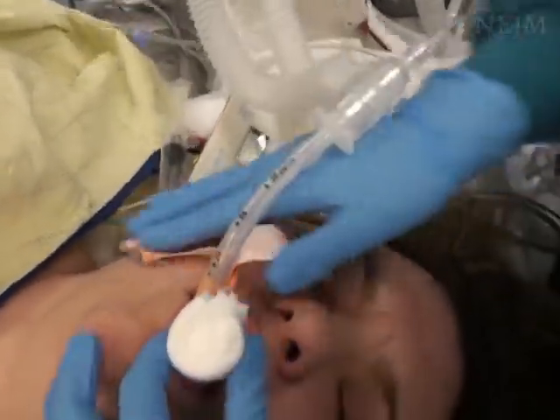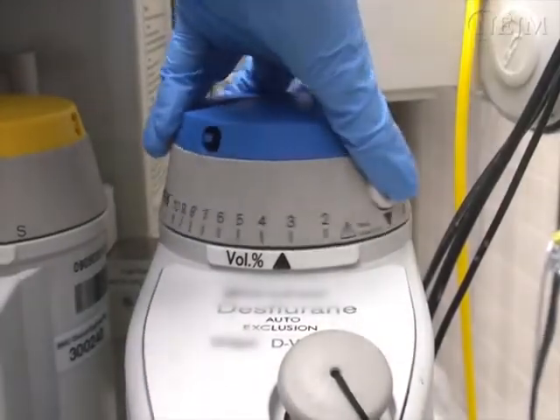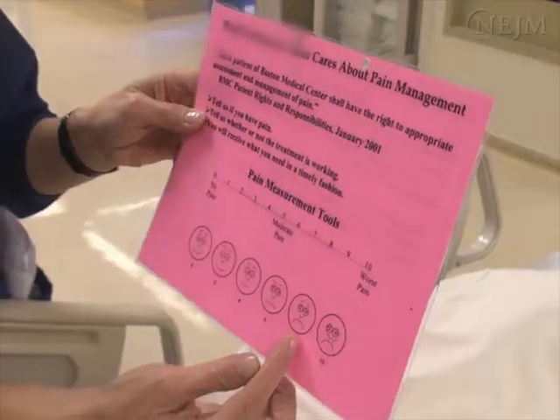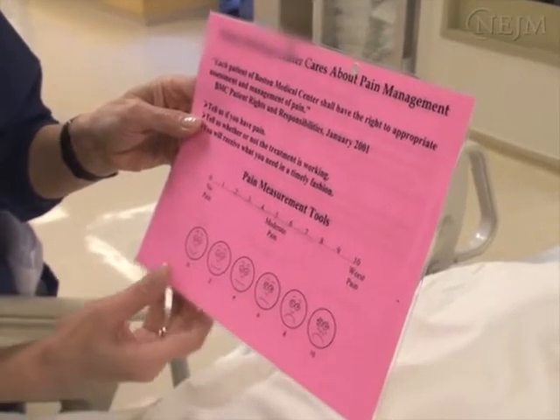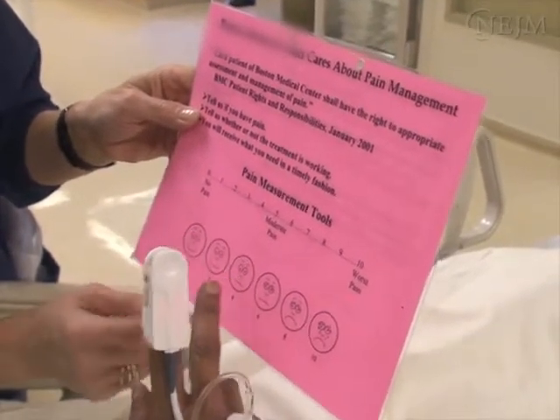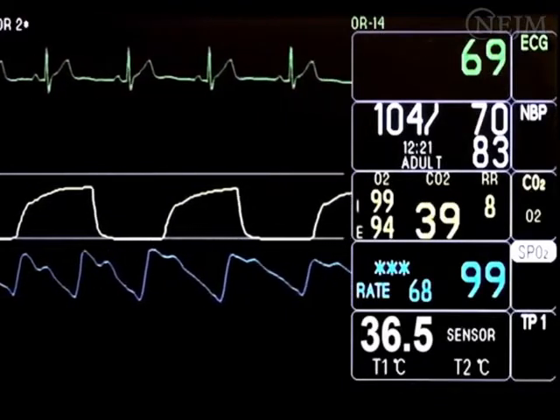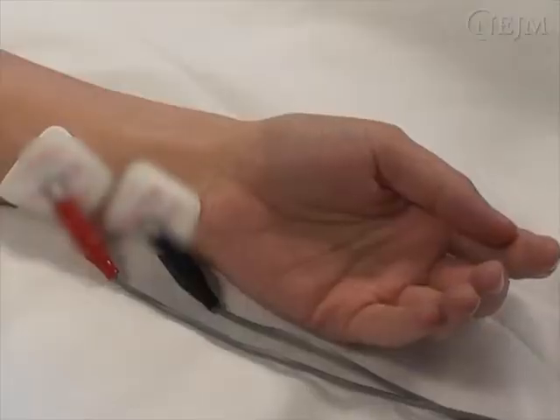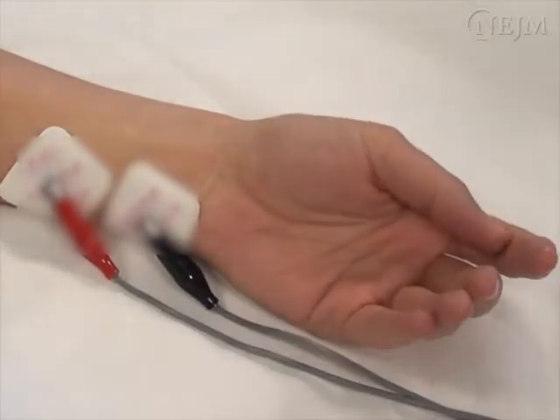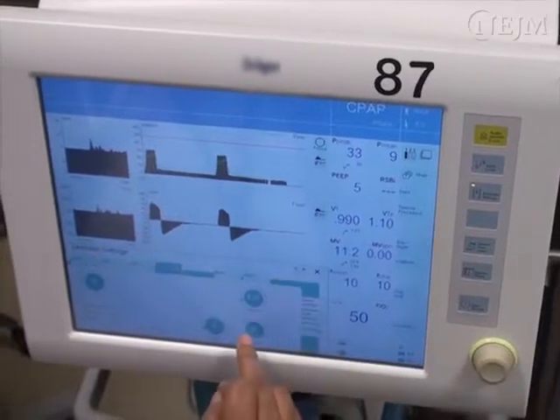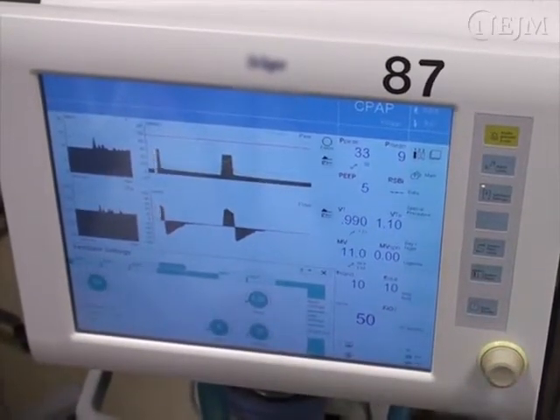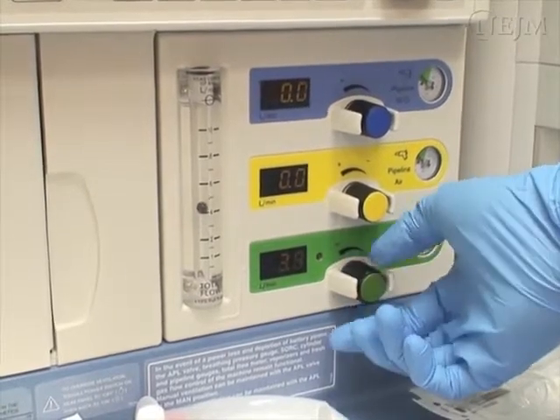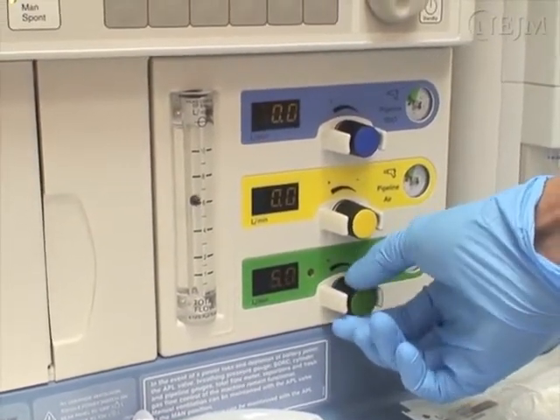Endotracheal extubation is usually performed when patients are awake or have emerged from general anesthesia. Ensure that adequate pain control is being provided before extubation. If the patient is awake, a visual analog scale can be used to assess whether the degree of analgesia is adequate. Cardiovascular stability, normal acid-base status, normothermia, and intact protective airway reflexes should be present. If neuromuscular blockade was induced, make sure that the blockade has been fully reversed. In preparation for extubation, adjust the ventilator to ensure that adequate respiratory effort is present with minimal support. Oxygenation should be maximized with 100% inspired oxygen delivered through the breathing circuit.